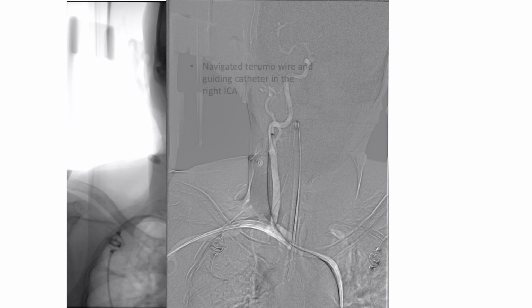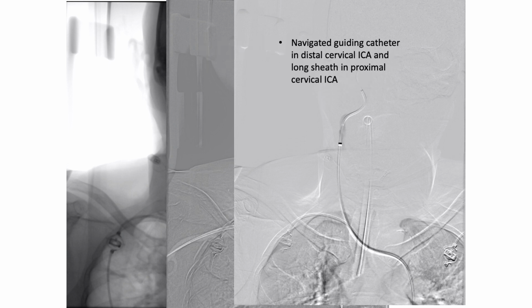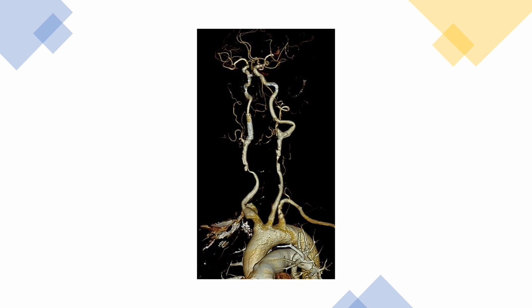We got this up here, and we could completely obviate the need for any direct puncture. Through this, you can easily take a DAC-like catheter and complete your procedure, a Neuron or a Fargo Max, any of these, okay? It's your choice. And this was the lesion we treated.